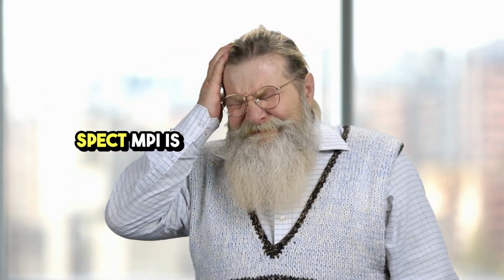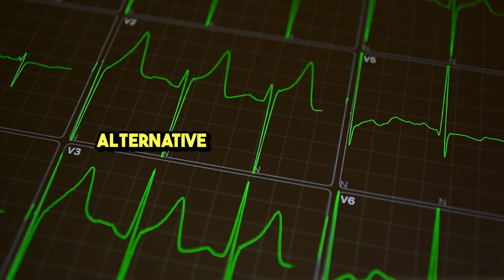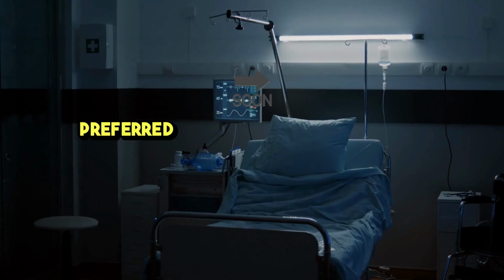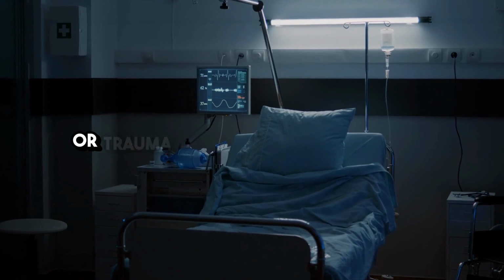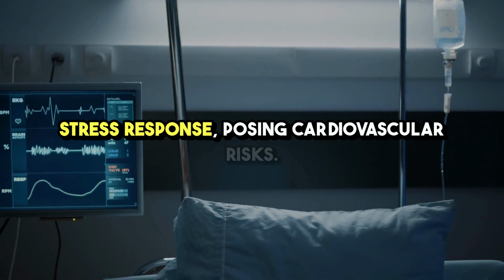tests. Patients with uncontrolled or high-risk arrhythmias face increased risks during stress testing, particularly with pharmacologic agents. SPECT MPI is generally avoided during pregnancy due to radiation concerns, with alternative non-radiating tests preferred. Stress testing soon after surgery or trauma may exacerbate the body's stress response, posing cardiovascular risks.